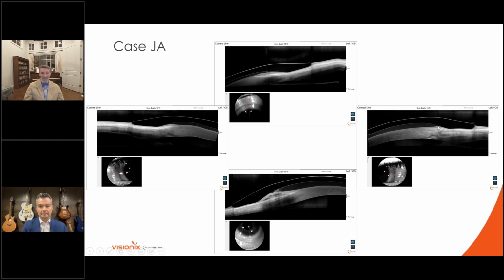Now we can see your cursor, Emil. It's just slamming the heck out of the limbus. And that's why this patient is red. What you'll notice is as you get off of the limbus in patients, they will have less redness and they will have greater comfort. And that's a lock. Let's go to the next slide.